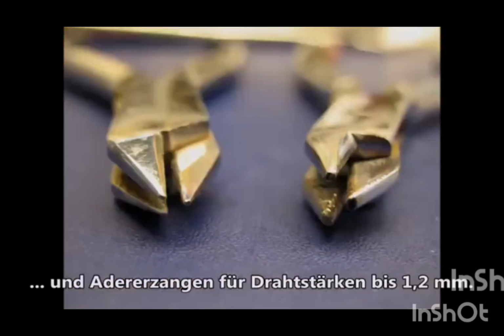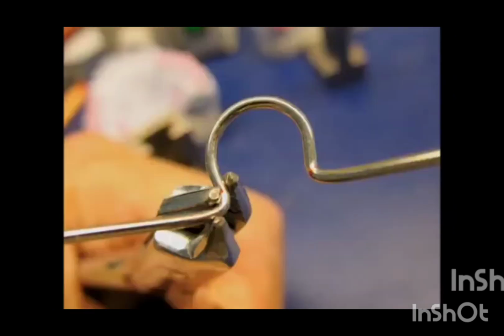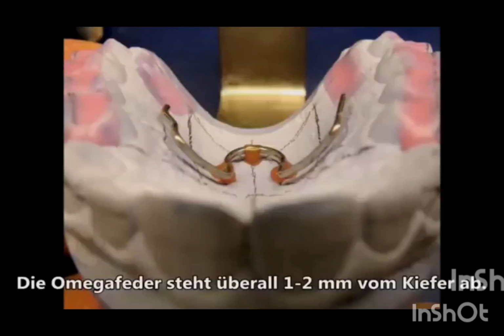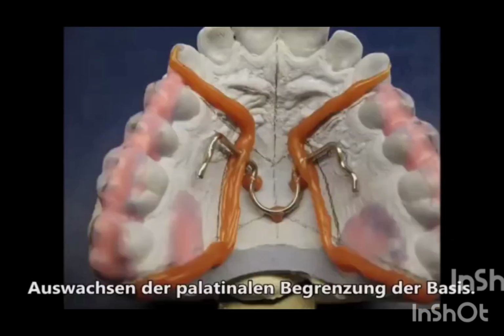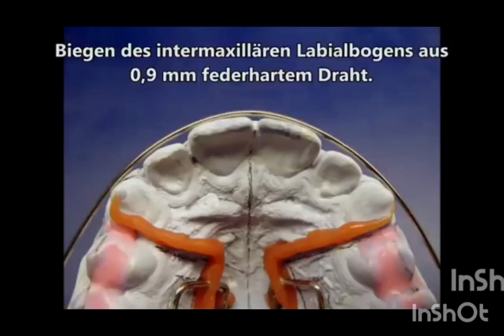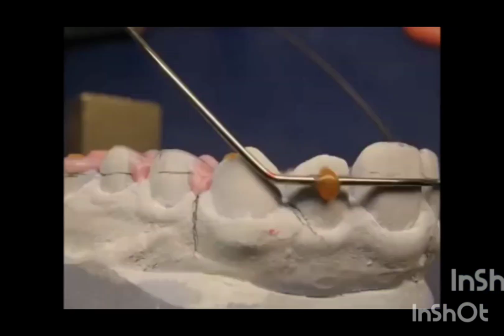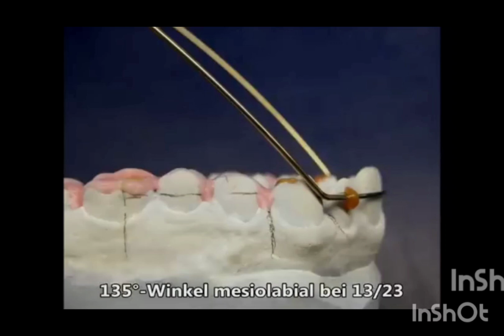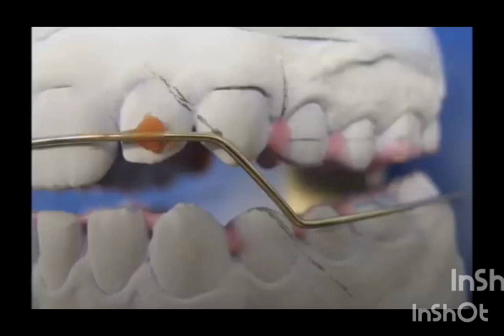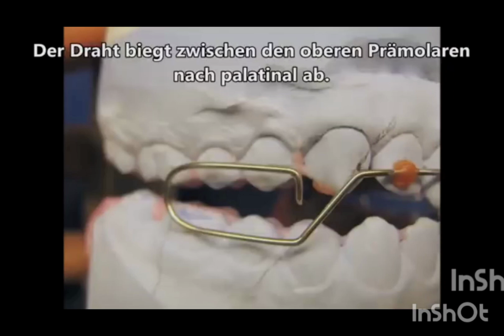These are the 3-prong pliers used for the fabrication. Then the coffin spring. The coffin spring has to lie 1 mm above the palate. This is how it is stabilized with the help of the wax. Fabrication of the labial loop or the vestibular wire, which eventually forms the buccinator loop. Now this is how it goes around. It gets embedded in the acrylic.